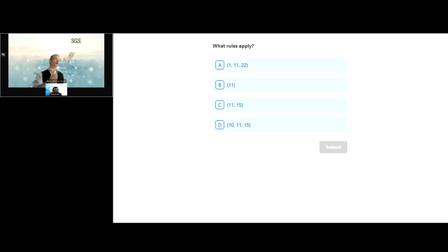While you're thinking, let me give this for everyone who's not working on the question. The single best piece of advice I can give for everybody to any notified body that you ever submit to, always remember that we have a very small number of days with your technical file compared to how many days you've had your technical file. So always assume that we are not as familiar with the device, not as familiar with the documentation. Always assume that compared to you, we are ignorant, because the answer is, in many ways, we are. We're doing our best.